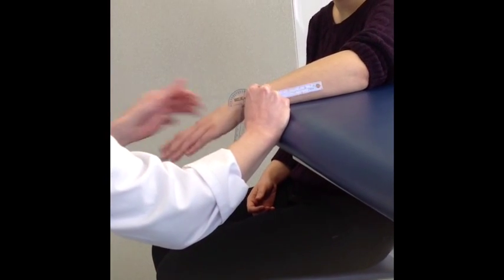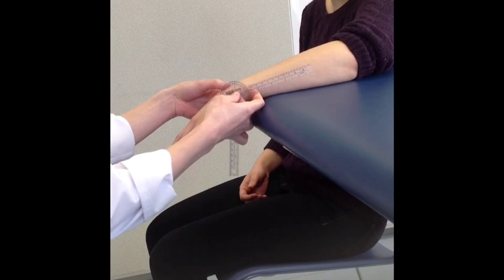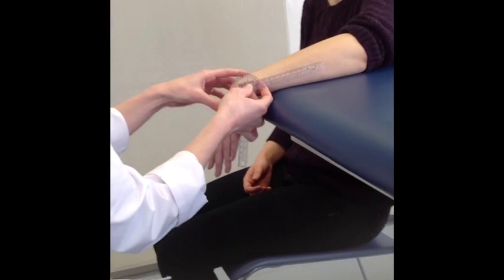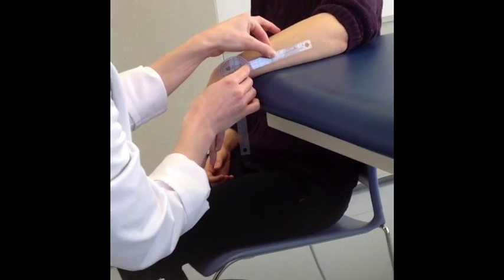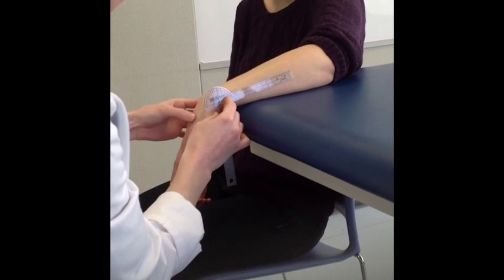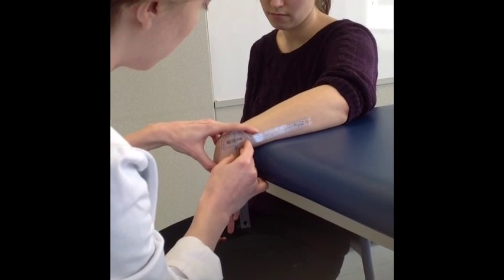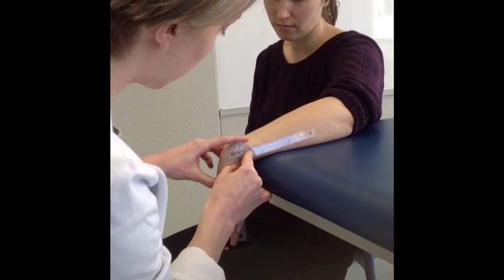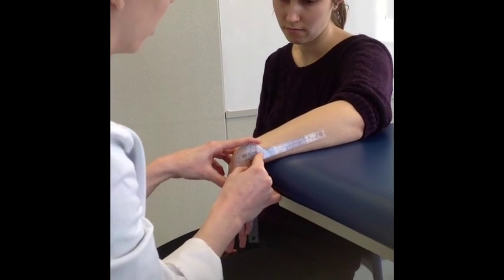Go ahead and relax. And then we're going to do the same thing for passive range of motion, except this time the therapist will push down through the third metacarpal into that end range of motion. Okay. So we're lined up: lateral midline of the ulna, the olecranon process, triquetrium, and then you're just going to press down on the third metacarpal. And in this case, passive range of motion equals active range of motion, which is about 70 degrees.